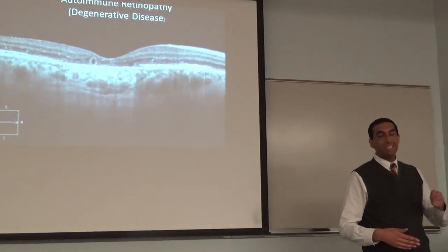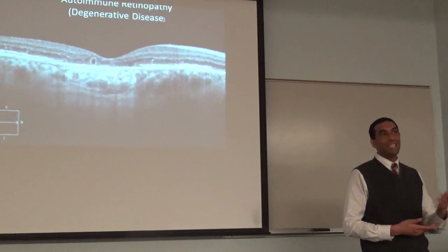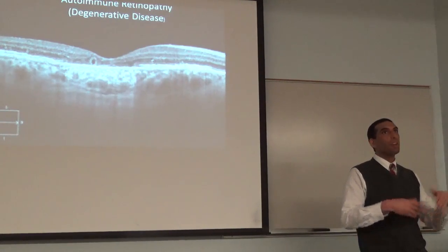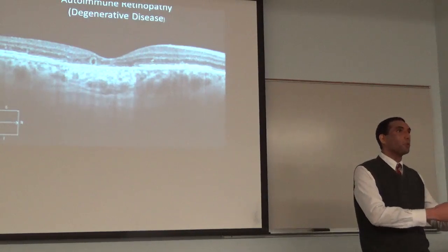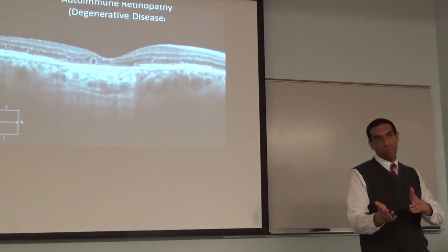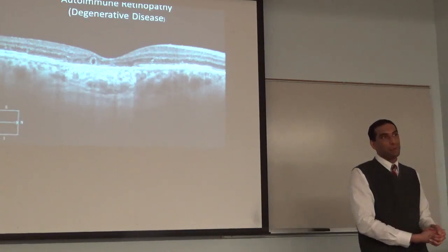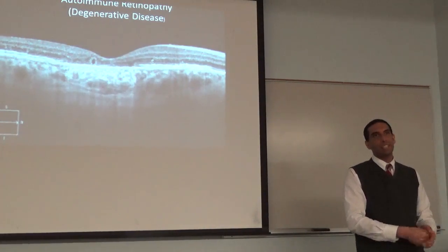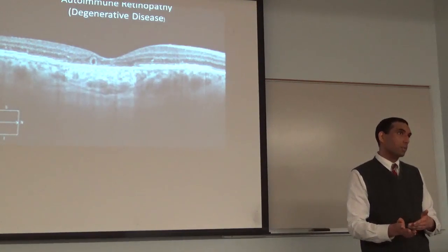Now, we actually have portable handheld OCTs. So if we need to get an OCT on a 30-day-old, I've done it. We take them to the operating room. We don't do any surgery, but we sedate them with an anesthesiologist under general anesthesia, and boom, we go right over the eye and we can do it. So it's amazing just how flexible this technology has become.